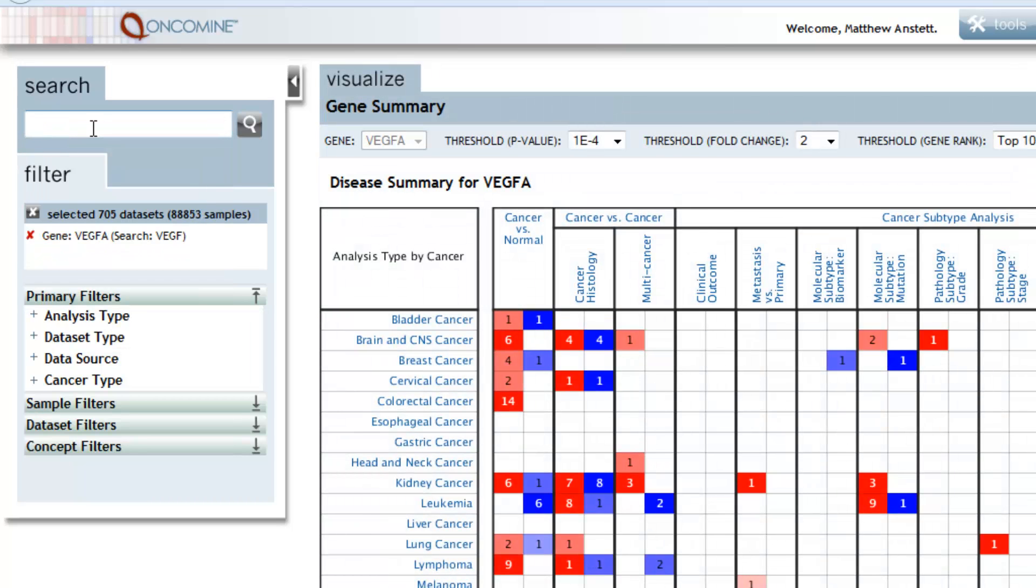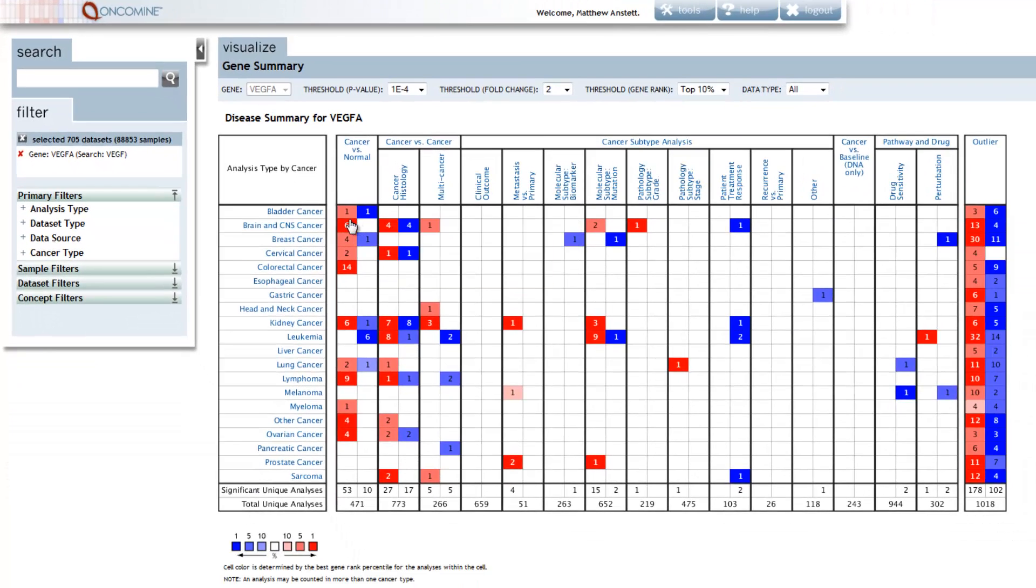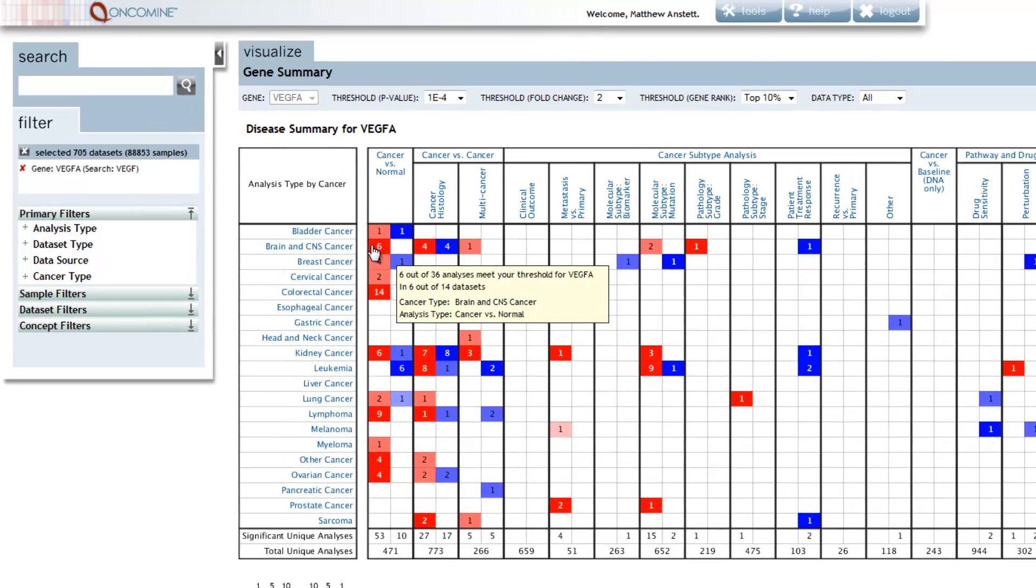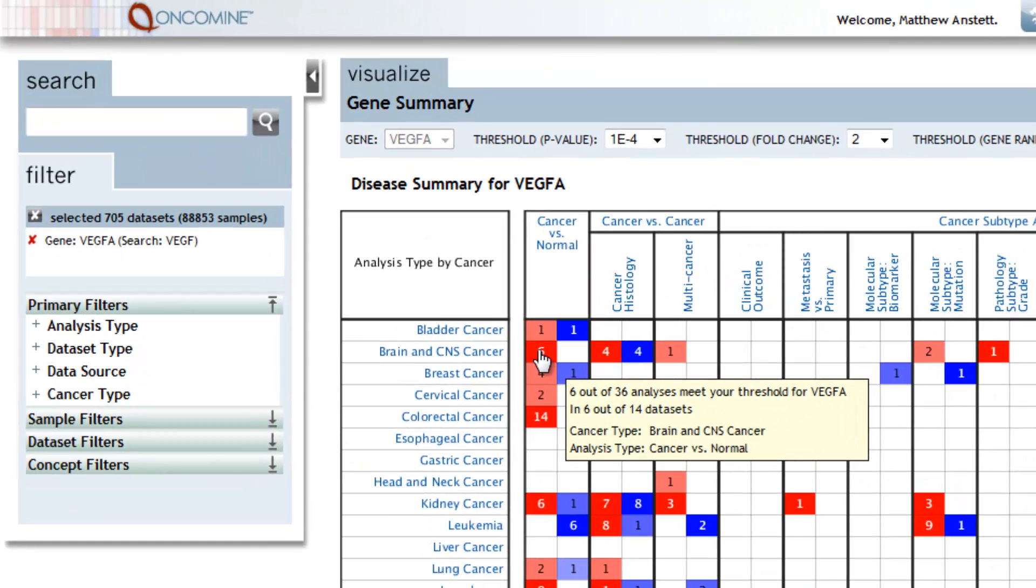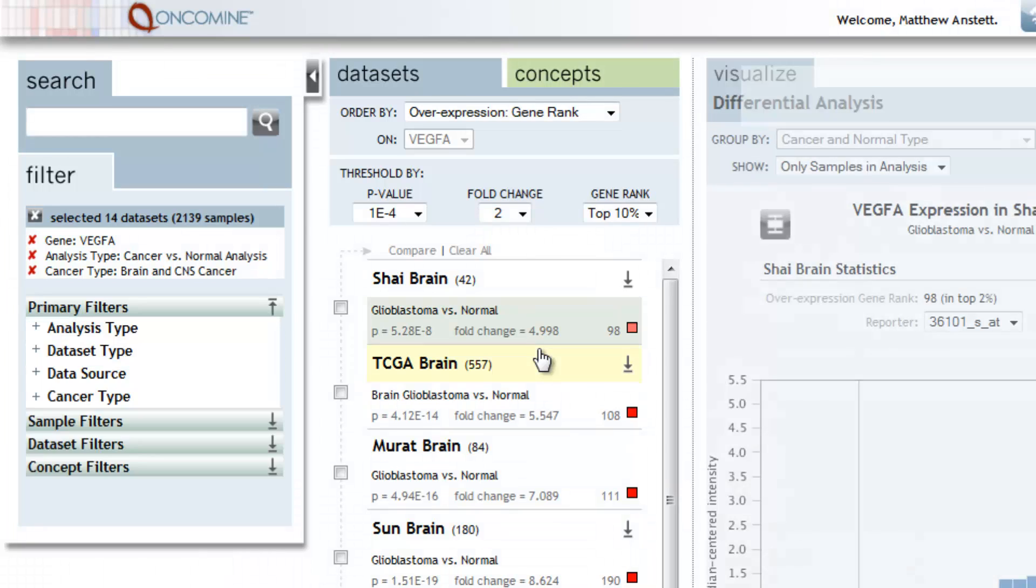The search reveals across 705 datasets over 88,000 samples, we have a number of results. These results are summarized across cancer types as well as across analysis types. By focusing on six results for overexpression in brain and CNS cancers in the cancer versus normal analyses, we can drill down to investigate each of these results independently.